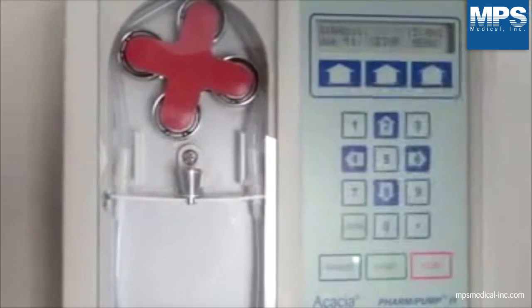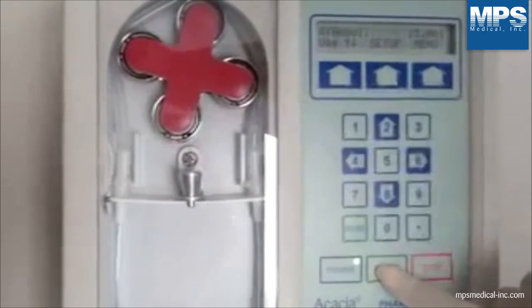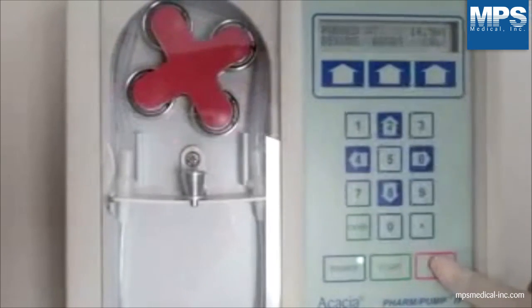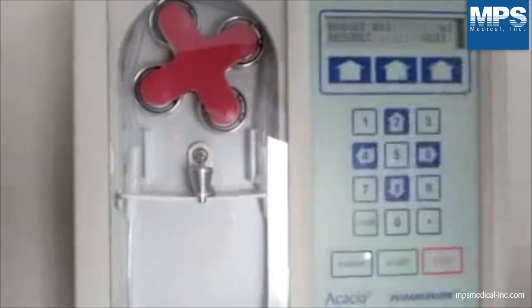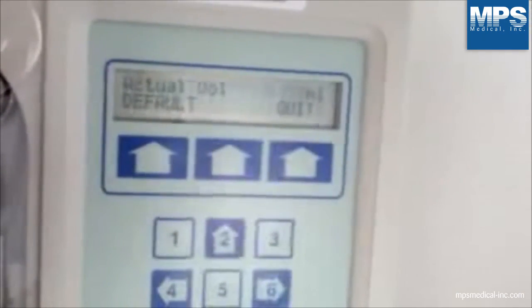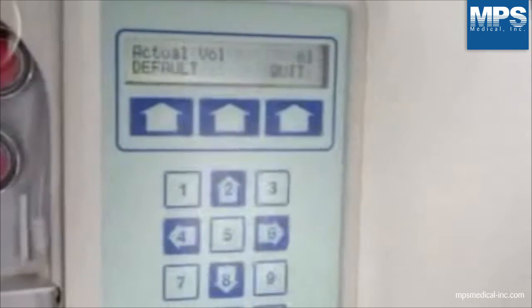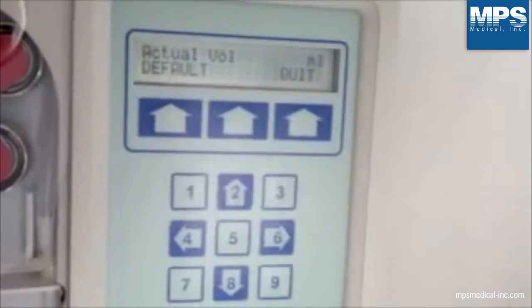Measure the volume that was dispensed. Press the cal key on the right side. Enter the volume that was displayed by using the numeric keypad and follow it by pressing enter. You will then press the quit key. Afterwards, press the resume key to finish filling.